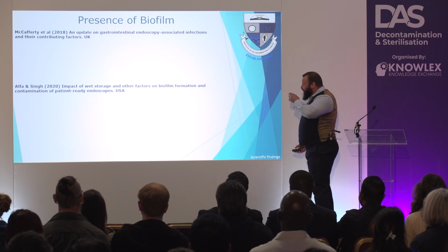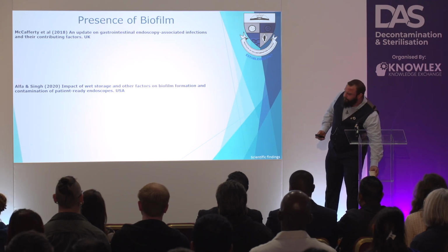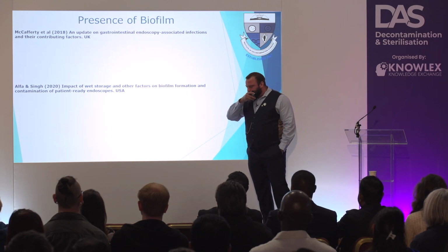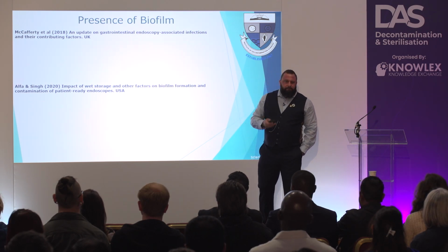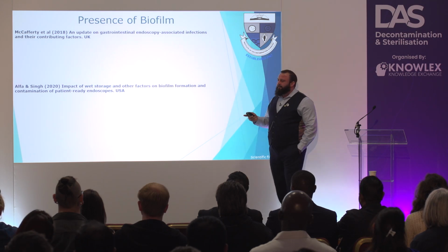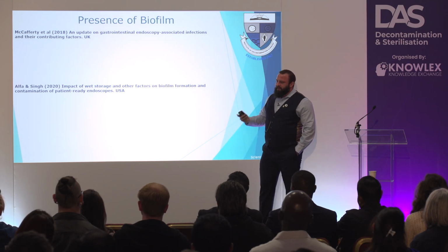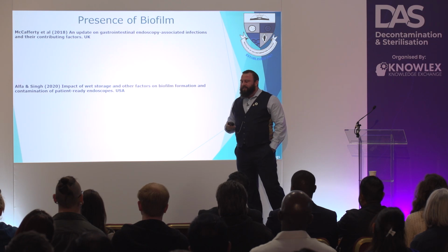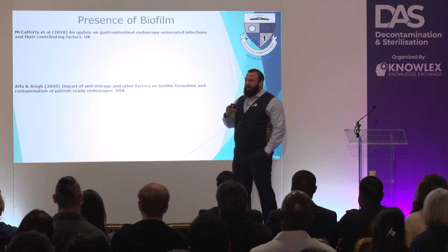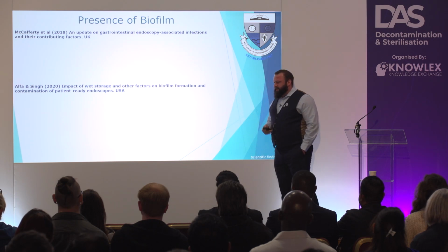But don't take my word for it. Let's have a look at some scientific studies. Now, these are fairly recent, over the last 6-7 years, and I've tried to keep them mainly in the UK and the US, where we know we've got standard practices, and we're doing all the current decontamination processes, peracetic acid, drying cabinets, using them within 3 hours, all of that business.